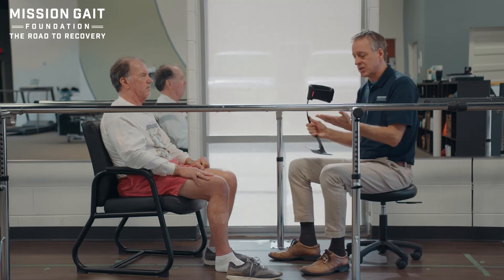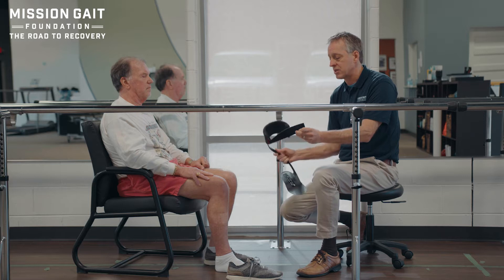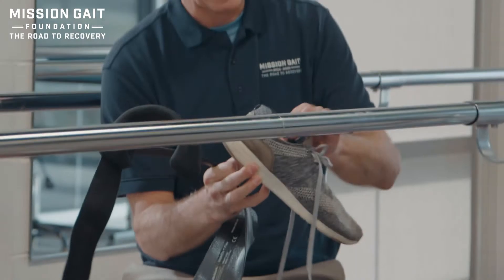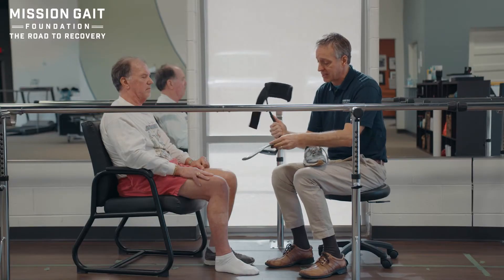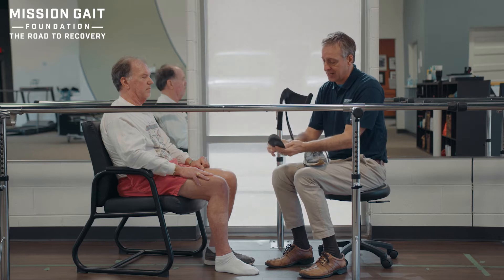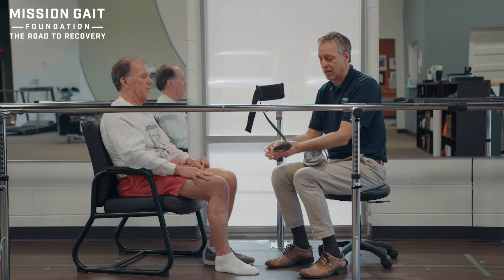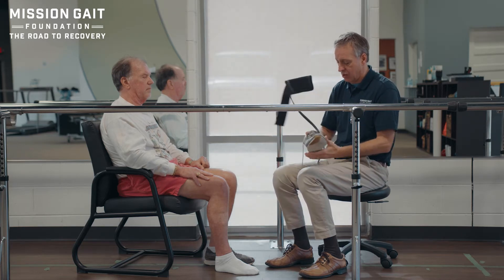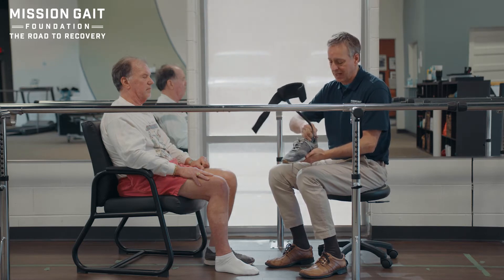I'm going to put it on the patient to start with. First, these are simply Velcro closure, like most, so we're going to open it up. I'm going to take his shoe, use the insert that he has in the shoe, and the first thing I'll do is put that insert on top of the plate and look - generally, do we have the right size? Have we got the general alignment and length right? If so, we slide those two together. Always the best way on this type of brace is to put them in the shoe and then fit the shoe onto the patient.